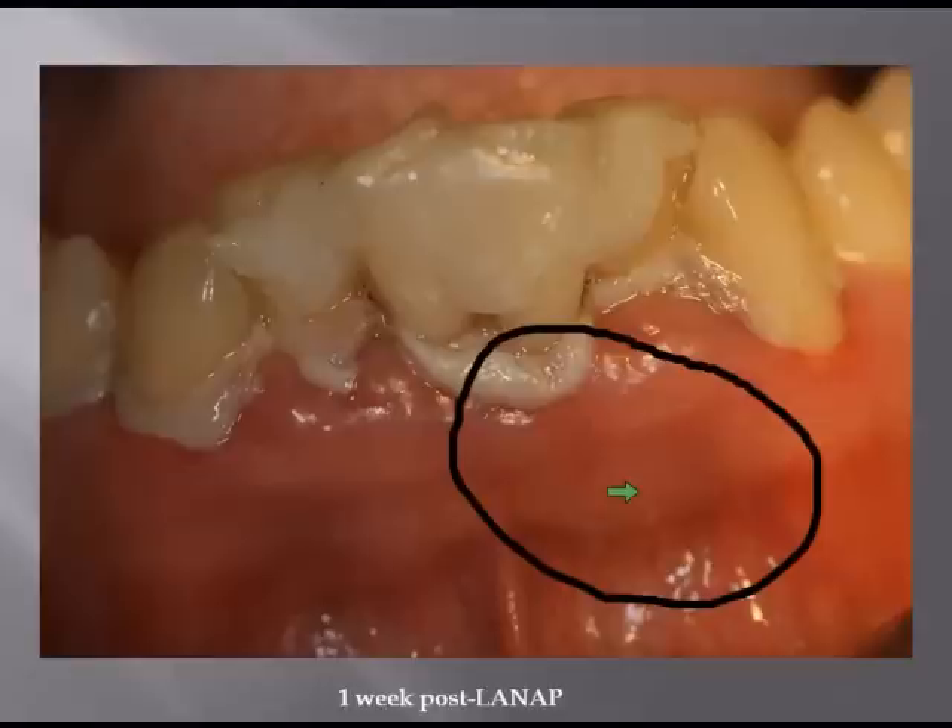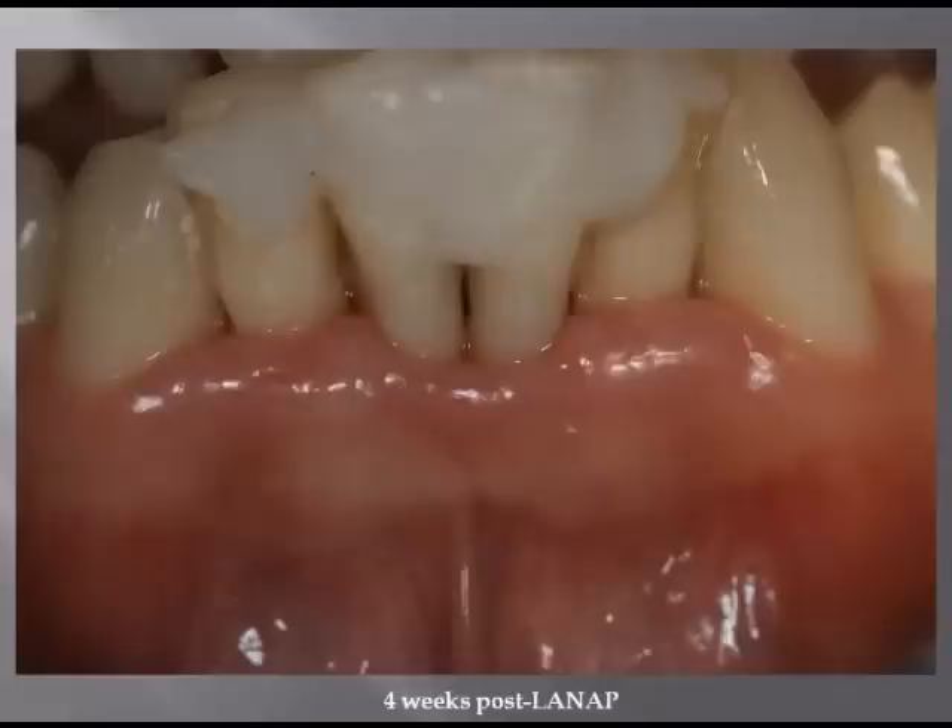With LANAP, we're getting healing from the base of the pocket up, not from the gingival margin down, which happens in scaling and root planing — which is why we can't accomplish with scaling and root planing what we can with LANAP. This is one week post-LANAP.